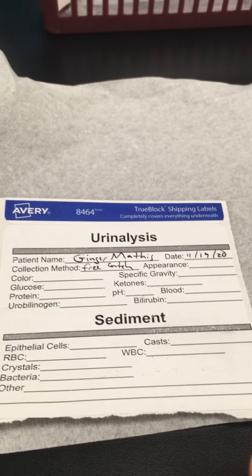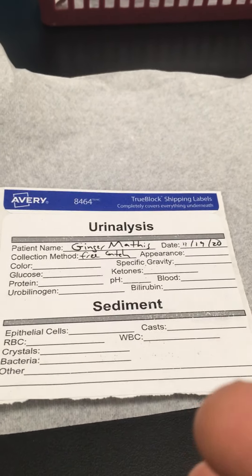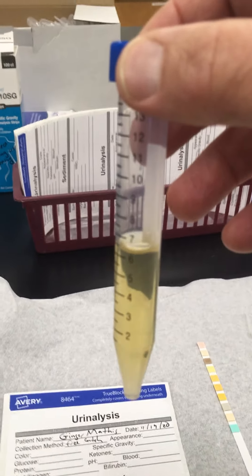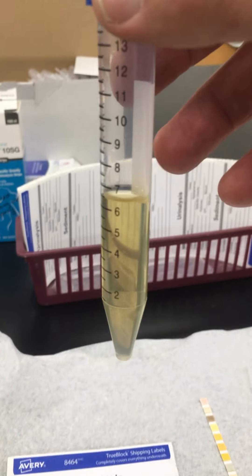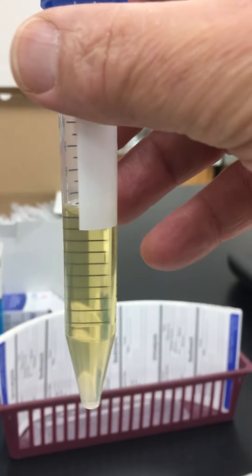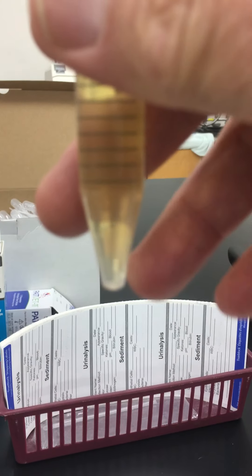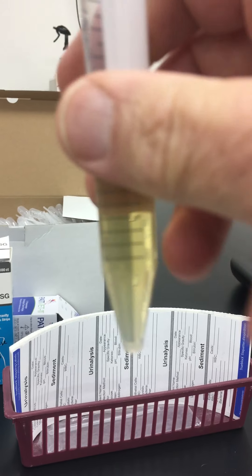You'll be doing the physical and the chemical part of a urinalysis. The third part, which is sediment, you would need a centrifuge. We'd use a tube like this so that if there's any sediment, it would collect at the bottom.